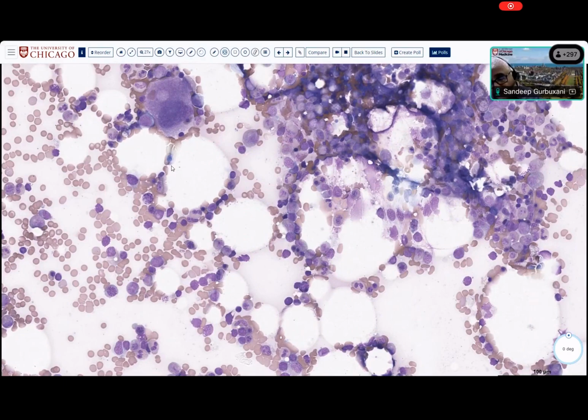My recommendation is, if you are going to evaluate a bone marrow for a myeloid malignancy or leukemia or an MDS, take the time to do a 500 cell count. It will make you commit to the morphology of the cells. And then for entities where the blast count is important, or when the monocyte count is important, the monoblast count is important, you will get a much more accurate count.